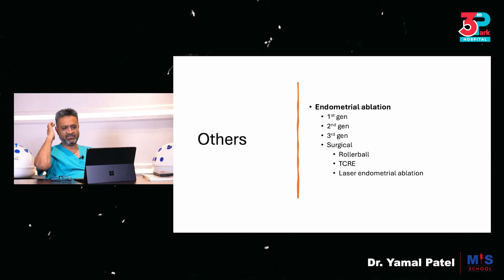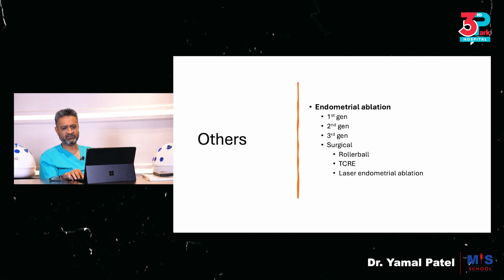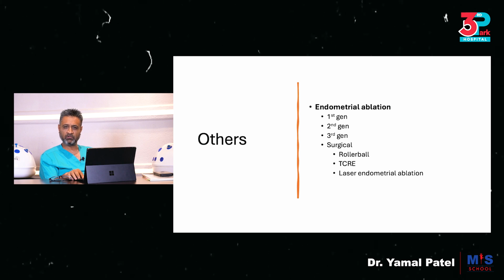And we then have the endometrial ablative procedures where you have first generation, second, third generation, and now we have the surgical procedures which we were supposed to have discussed: rollerball, the transcervical resection of the endometrium, laser endometrial ablation is an option, and these are not discussed in this specific talk. We might take it up separately.